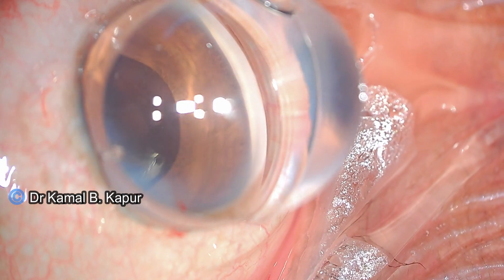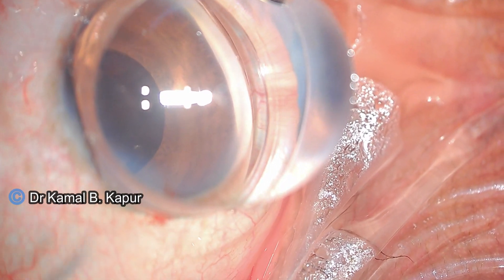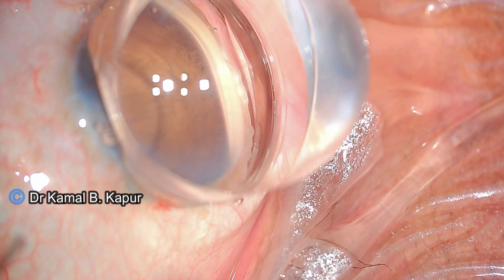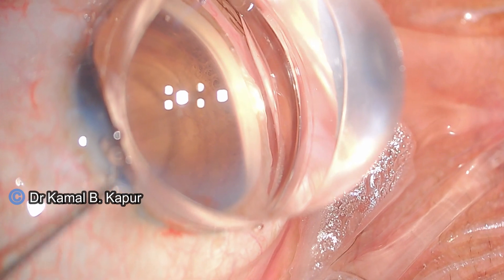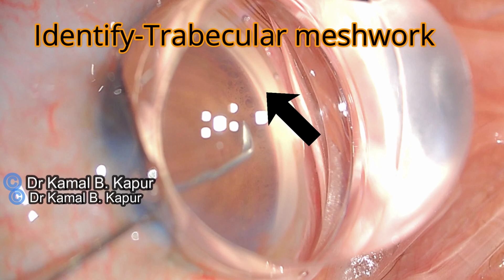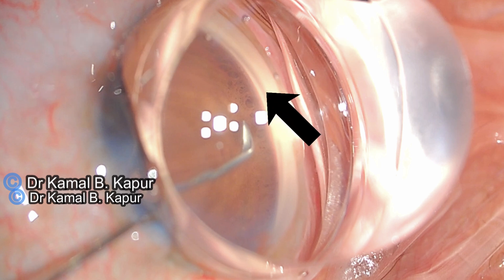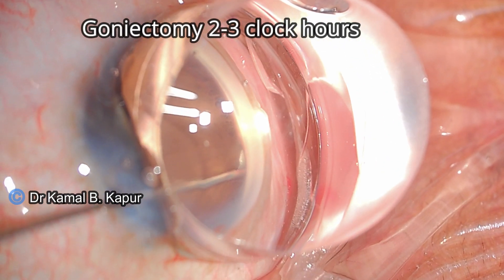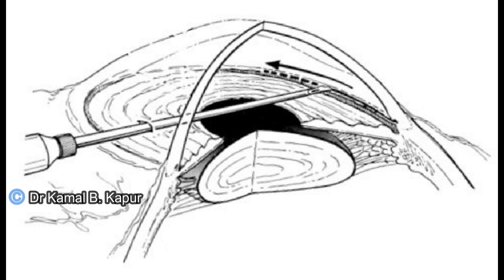We then proceed to insert the needle through the side port we had created. This should be started the moment we get the en-face view of the trabecular meshwork. Once that is achieved, we go in to the trabecular meshwork and scoop or excise it for approximately two to three clock hours — that is, 60 to 90 degrees. Removal of this trabecular meshwork ensures completion of the procedure.